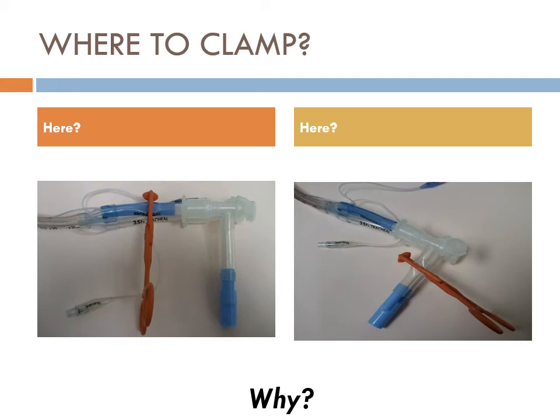If you were to ventilate through here, like this, what's going to happen? Same situation, but now it's a different bronchial side. What am I ventilating? Left lung, right lung, both lungs, no lungs? Which side am I ventilating through? I'm on the left bronchial side, so I'm ventilating the left. Where's the air going to? The left, but the cuff's not up. So it's also coming out of the left side, and it's ventilating into the right side, but it's also coming out of this open tracheal port. See?